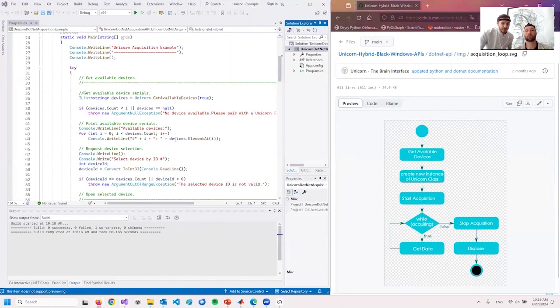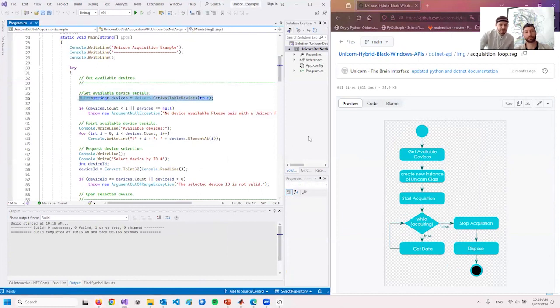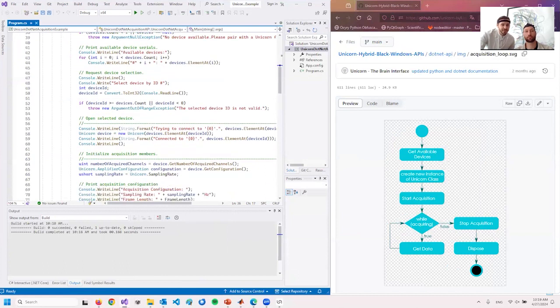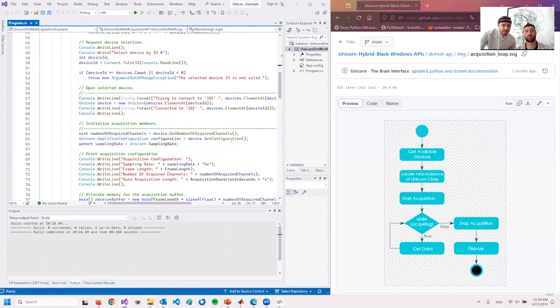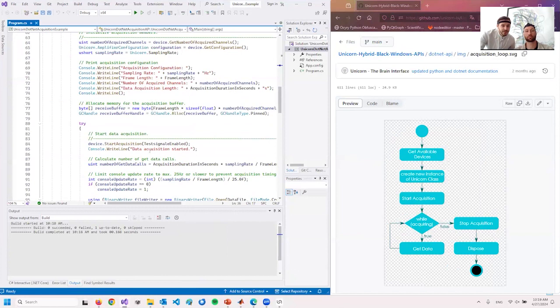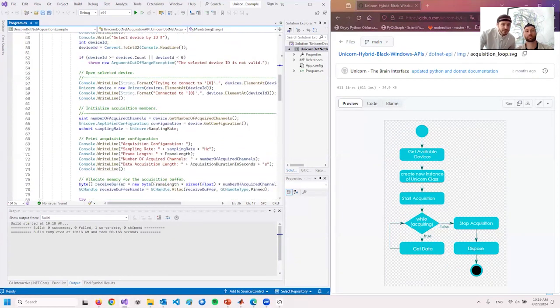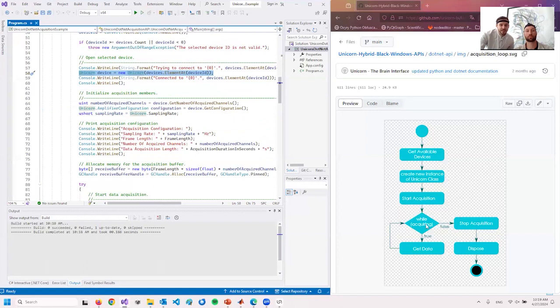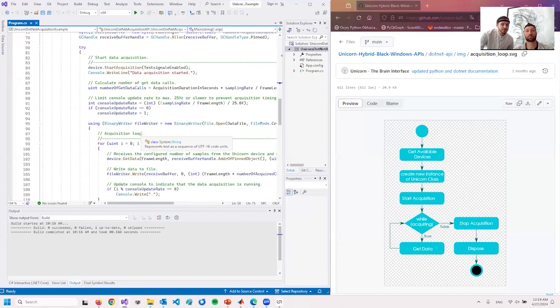First of all, we want to acquire the available devices. Therefore, we call get available devices. That's the first section. Then we open our device. That would be the opening command, which is there. We create a new instance of the Unicorn class. That's the device. Then we enter a loop.